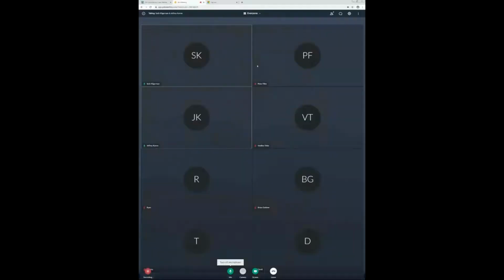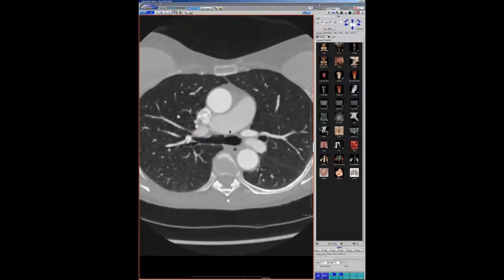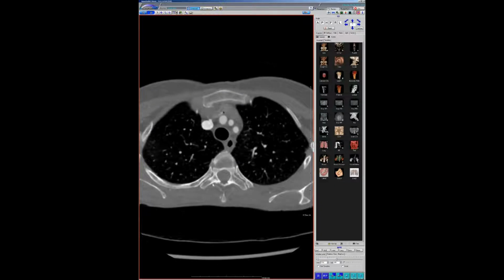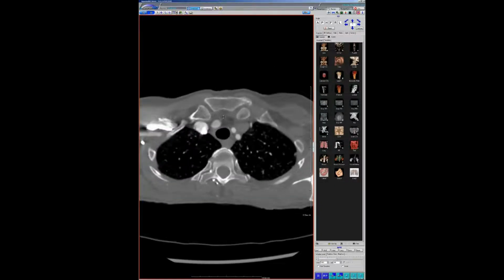So, Seth, if there's by any chance complete rings, there should be indentation on the back of the trachea. I looked. I don't see evidence of that here. I know you'd better see that with the CT bronchogram when I do that recon. Let me see, but it doesn't look like it. I could try to recreate that. Also, if there were complete cartilaginous rings, it shouldn't be so big. Yeah, it would look tighter, but yeah, I'm done.